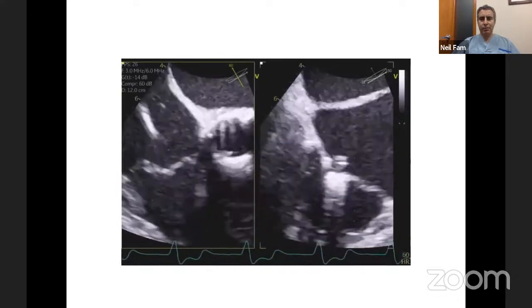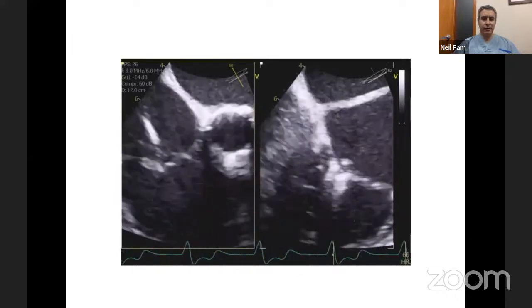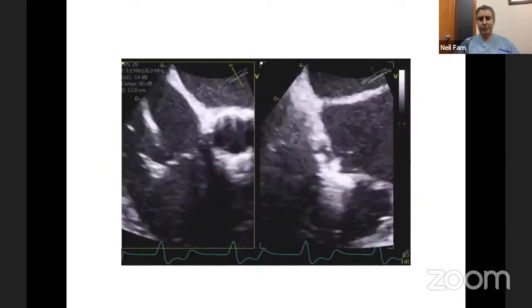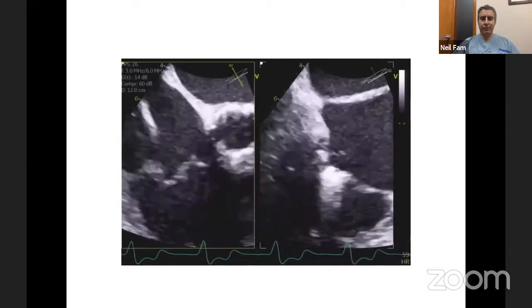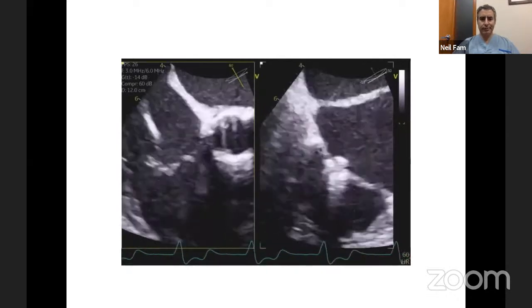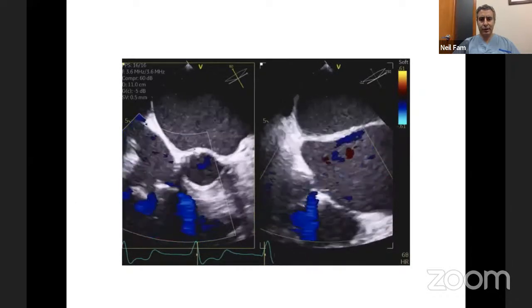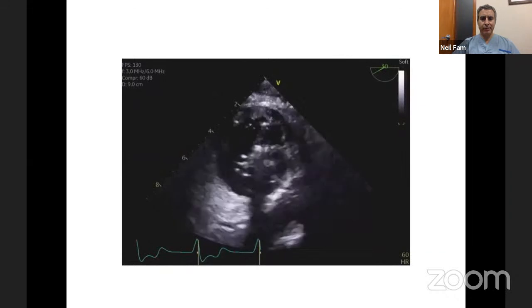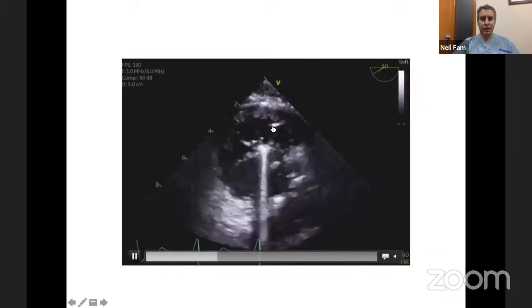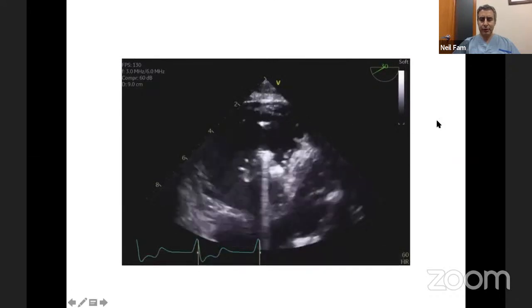As you will all appreciate, imaging of these procedures is critical. And if you don't have good imaging, you really can't be sure you have a good leaflet grasp, and half the procedure is confirming leaflet insertion. So here's after the second clip is deployed. We've got a nice reduction down to mild and excellent tissue bridge in the transgastric. This patient did extremely well. You can note up here, there's a pacemaker lead bouncing around in the posteroseptal commissure, but this had nothing to do with the mechanism of TR.